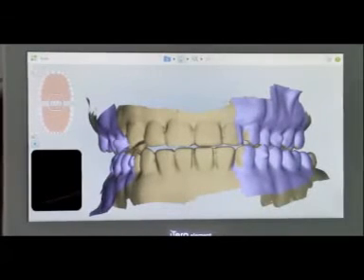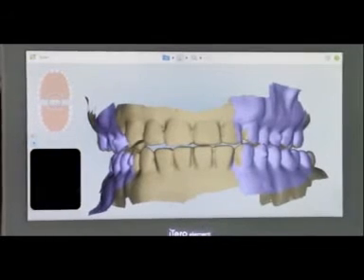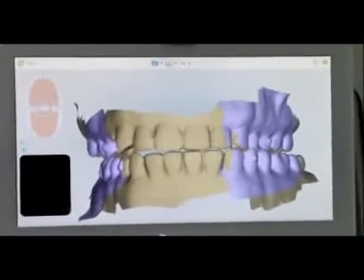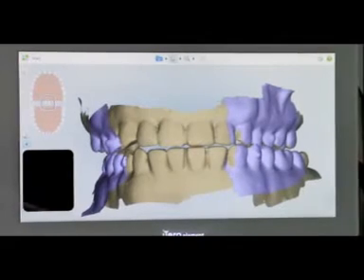How about if the patient has dentures? So I need to remove the denture then? No, you don't need to remove the denture, just a regular bite, unless you need something where it's dentureless and you need to record the bites without the dentures, then do that. But if you need the bite with the dentures, do it with the dentures. Yeah. Okay. Does that make sense?